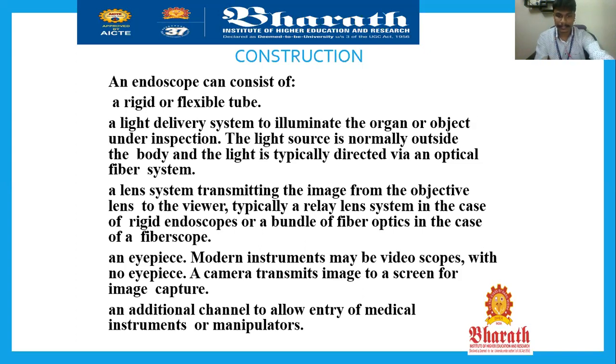A lens system transmits the image from the objective lens to the viewer. A system called the lens system is there that will be capturing the data. That captured data will be sent as an image or a video to the viewer who is watching it on the monitor.